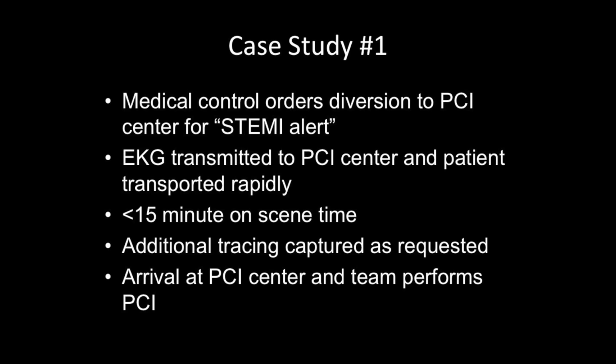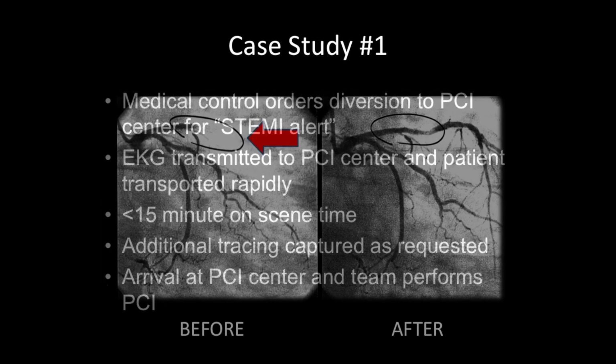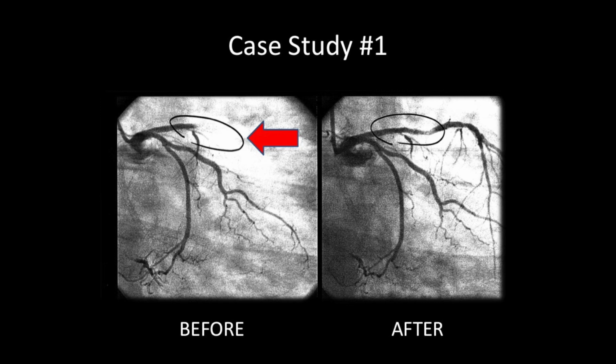Again, all of this doesn't happen like this, unfortunately, but that's their end of the pie, not our end of the pie. Potential for it, right. So this is actually what she had. So this is a cath lab image. They do fluoroscopy. Fluoroscopy means continuous moving x-rays, no different. It's basically all it is. It's like an x-ray movie.